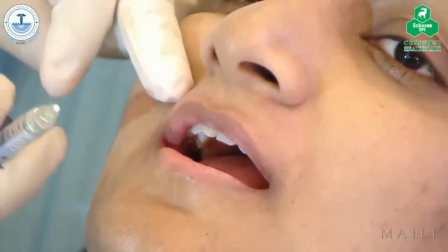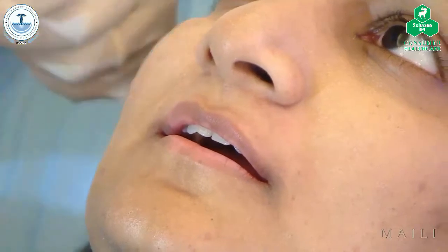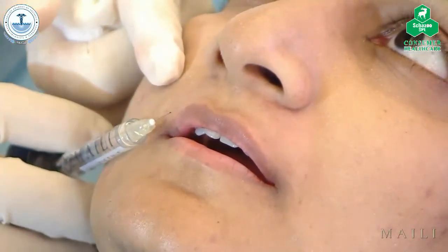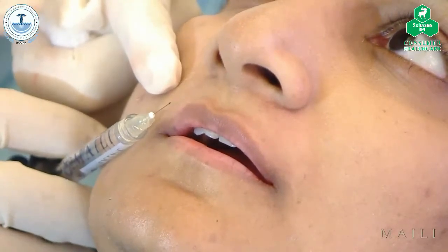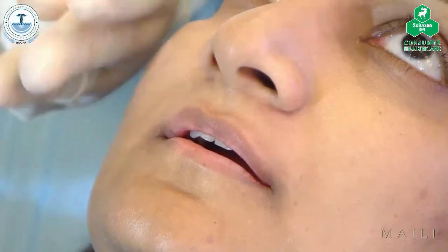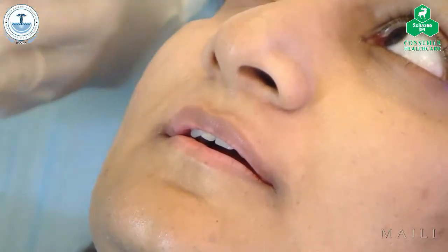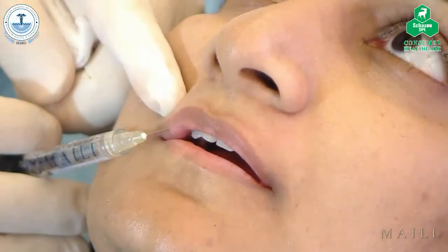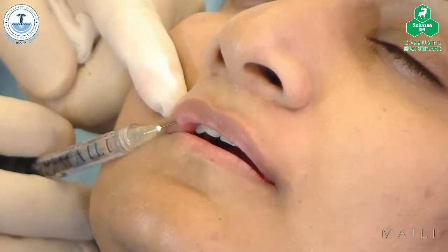Then I need support on the lateral part. And if I go closer to the vermilion, to the white roll or the skin-mucosa transition, I'm going to get projection and contouring. It's a very young face, young lips. They don't need contouring. The contouring is there. I just need to go a little bit under, just to highlight and add the volume.